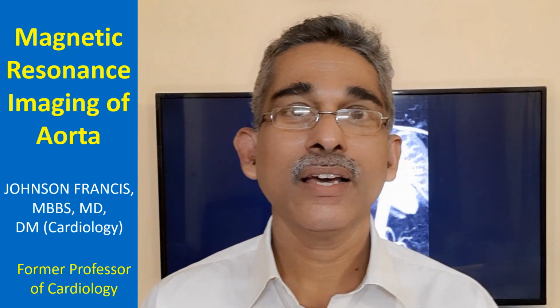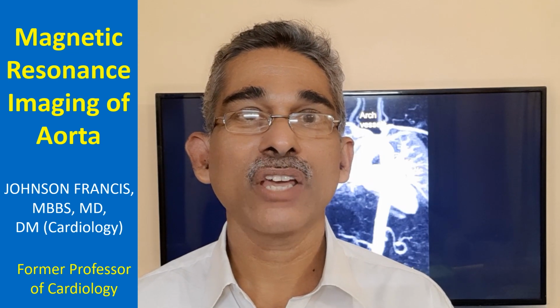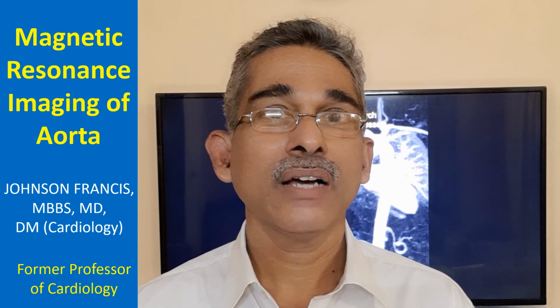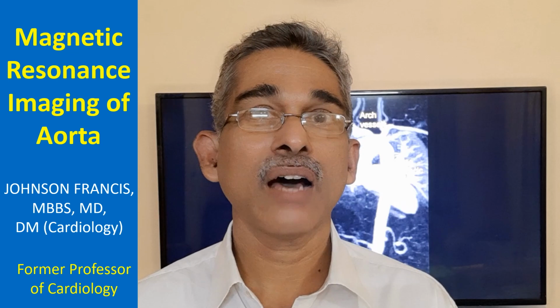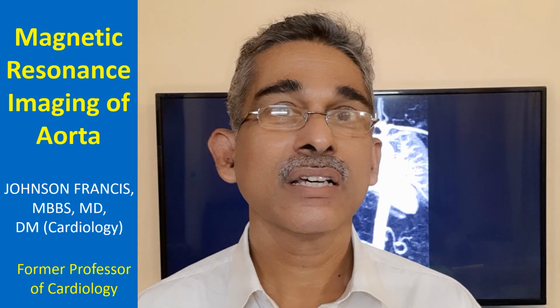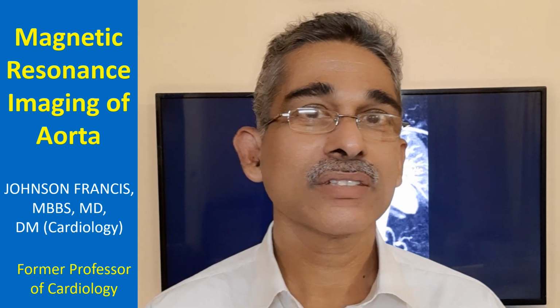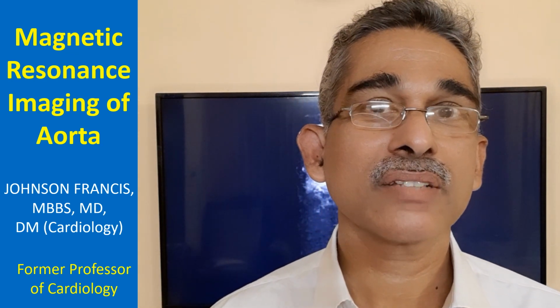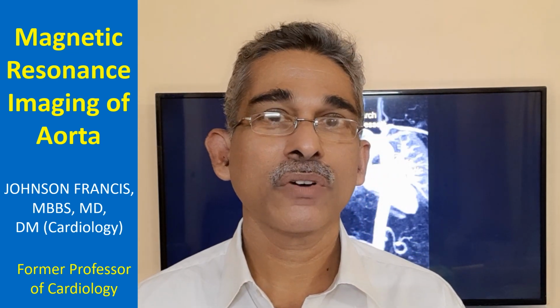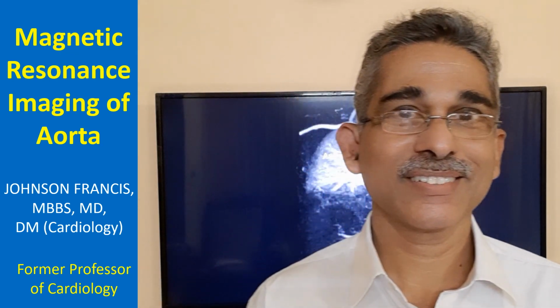Earlier it was thought that magnetic resonance imaging would be very much safer in patients with renal failure. Now, as gadolinium based contrasts are being used for magnetic resonance imaging, they cannot be used when there is renal failure, as there is a chance for progressive systemic fibrosis, known as nephrogenic systemic fibrosis, which can occur with the use of gadolinium based contrast for magnetic resonance imaging.